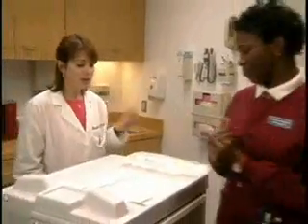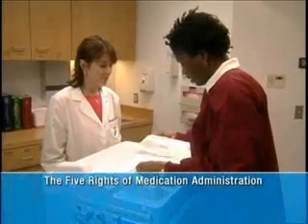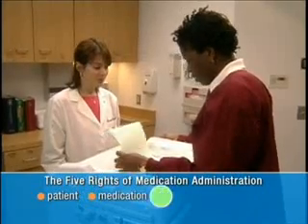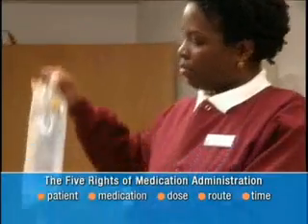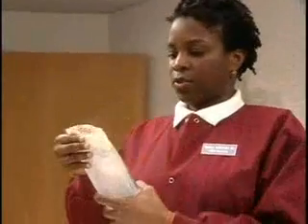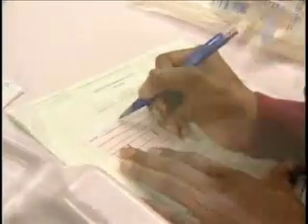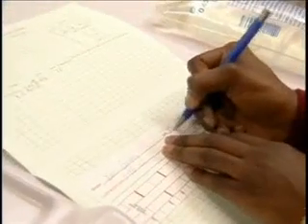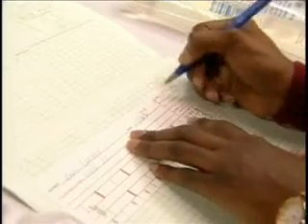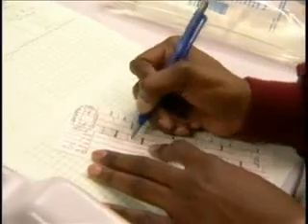Okay, let's use the MAR to compare the solution container label with the order to check for accuracy. Okay, the 5 rights should help with this. Sure will. Okay, everything looks good. Now, I check for leaks, impurities, and the expiration date. Great. Okay. Let's label the solution, Tamika. Okay. The patient's name, the solution type, and any additives, and the date and time the bag's to be started. And remember, if the container comes in with a pre-printed pharmacy label, confirm the information on the label with the record, all right? Okay.